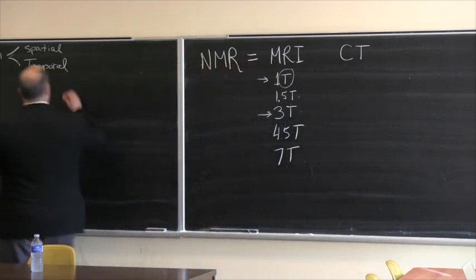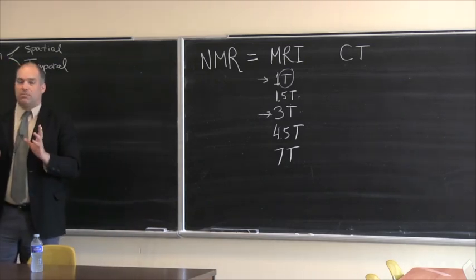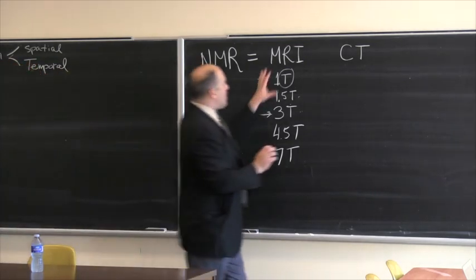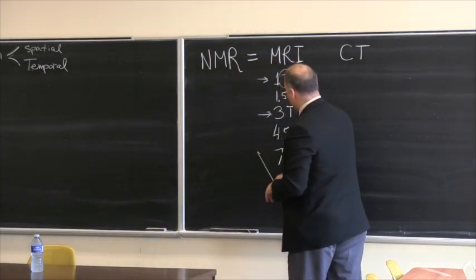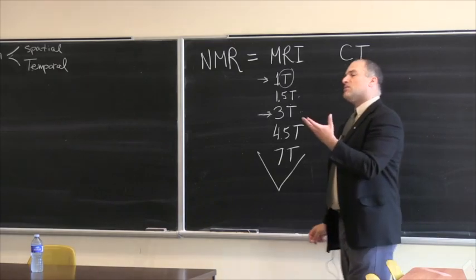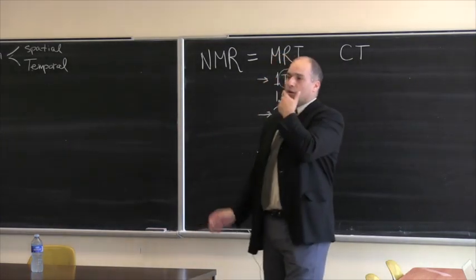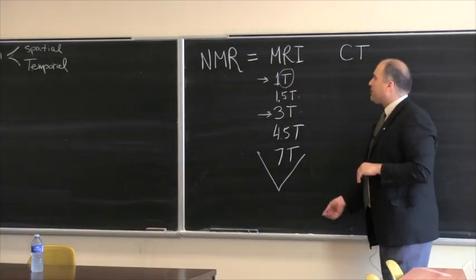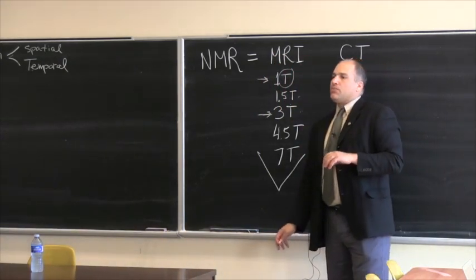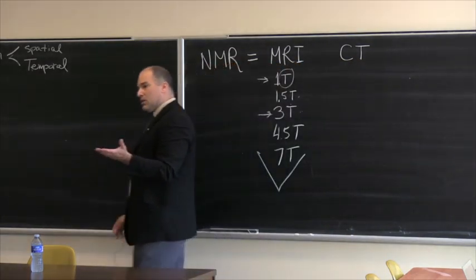Now, even with spatial, we have different ways of thinking about it, because MRI itself, depending on how you operationalize the MRI, you can do different kinds of snapshots. You can take different kinds of pictures that would show you different things. A lot of people, for example, when they use MRI, are doing volumetric studies. Now, what are volumetric studies?